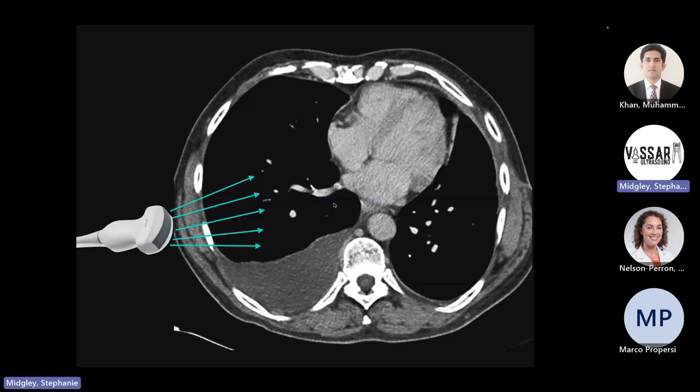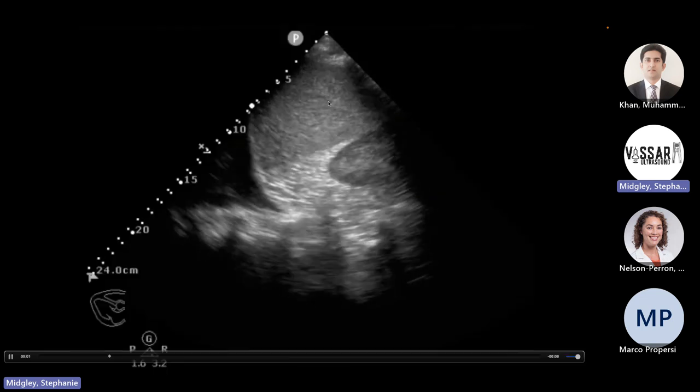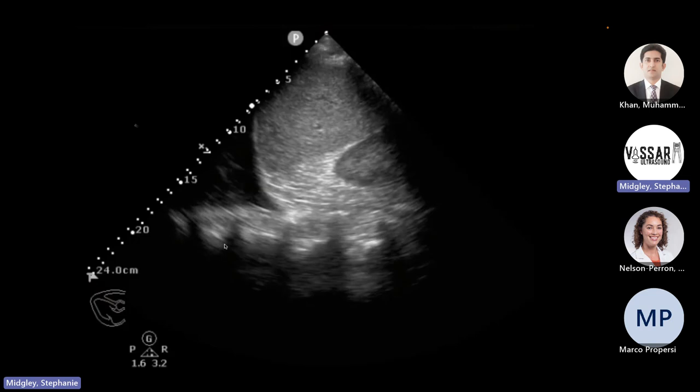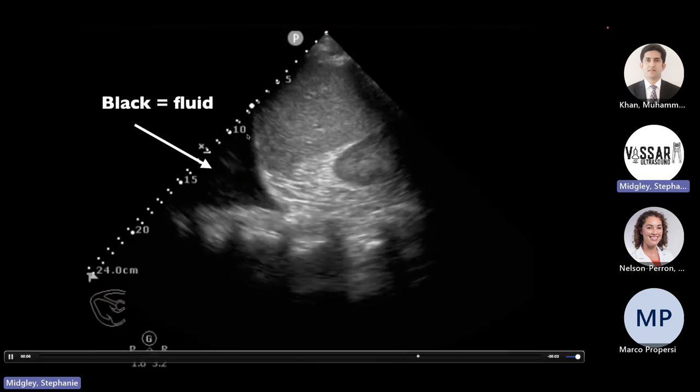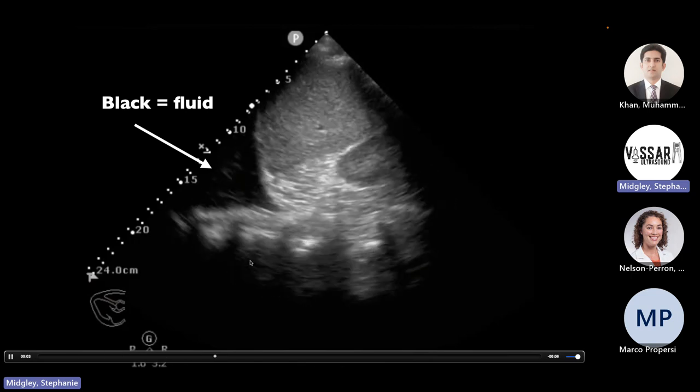When we're looking for pleural effusions, just understand that if you are tipped to anterior, i.e. you're not finding your spine, right, you're going to miss fluid. Because if you are scanning from more anterior on the body, and you're looking up, your beam is cutting through the anterior portion and you're missing that dependent stuff. So when you're scanning, just make sure you're tipping posterior to find that free fluid. So here's a great example of your spine sign, where you can see free fluid and the spine now all of a sudden continues up. So spine sign means pathology in the lung.